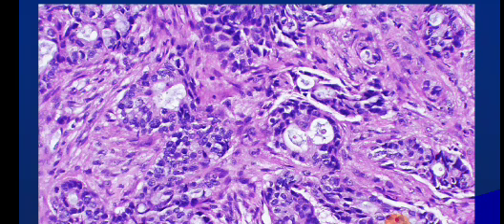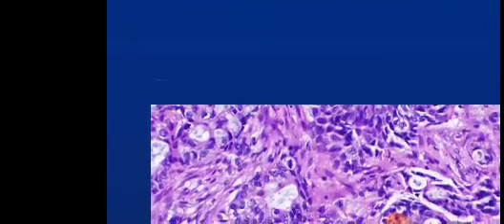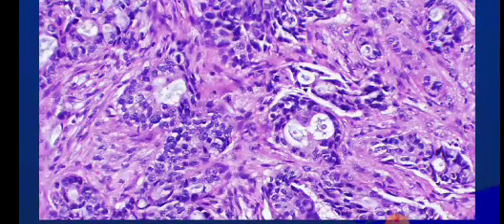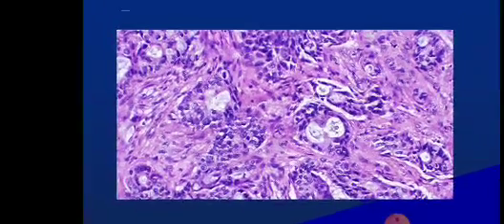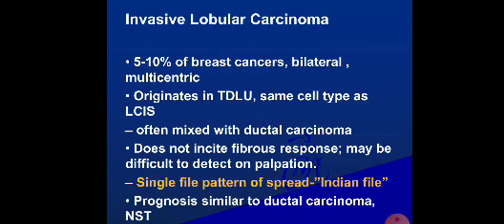So if you get all these findings, the cellular changes, malignant cells, and in this corner, I'm giving you, this is the mitotic activity, increased mitotic activity, abnormal mitotic figures there. Okay, or some ducts are showing secretions, calcification, microcalcification. So this is a typical picture of invasive carcinoma, ductal carcinoma of the breast.